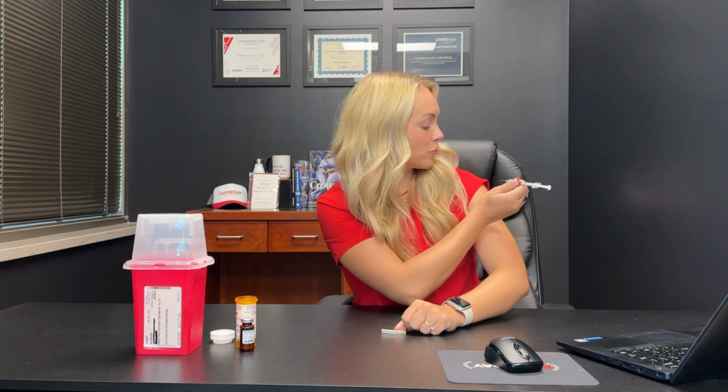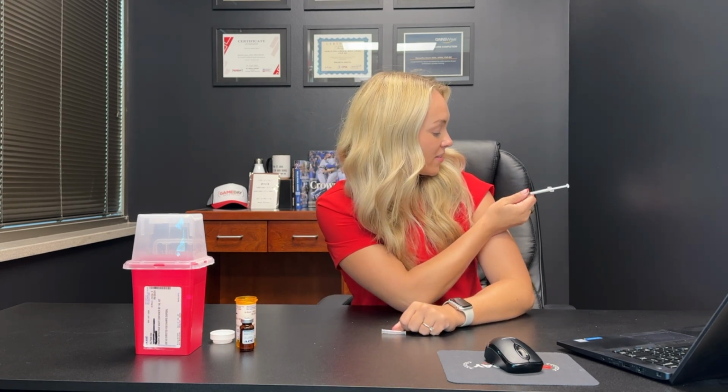To give yourself the injection, remove the cap from the blue needle. Take the needle and point it directly at the skin where you want to inject. With a firm and smooth motion, insert the needle into your skin and into your muscle. Once your skin meets the blue part of the needle, you can move your hand so that your thumb is on the syringe. You're going to apply gentle pressure to push that medication out of the syringe and into your body. Testosterone is a pretty thick liquid, so if you feel any resistance, that's normal.